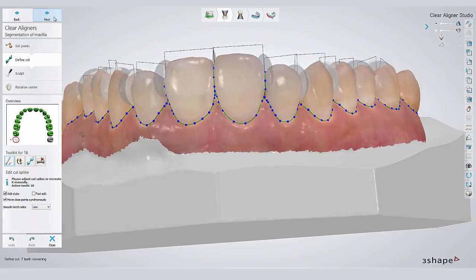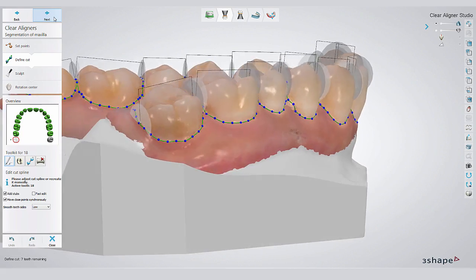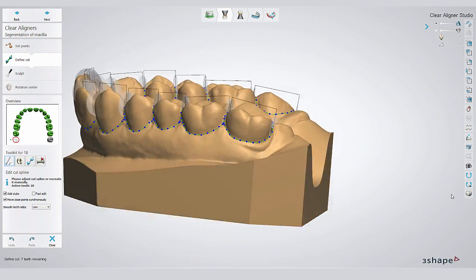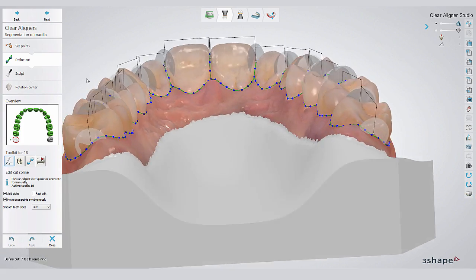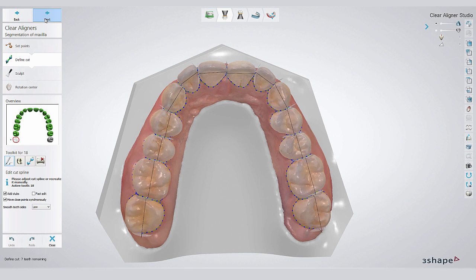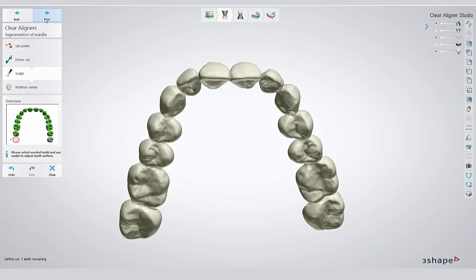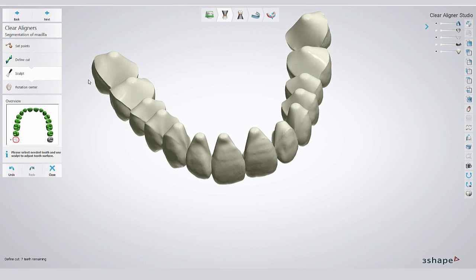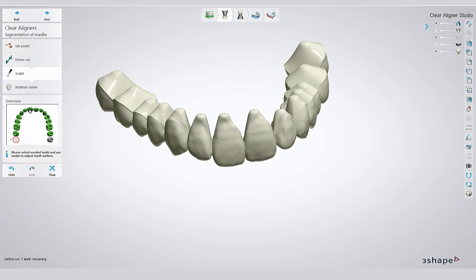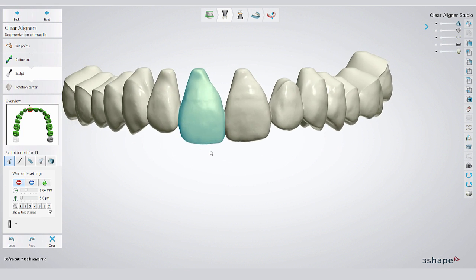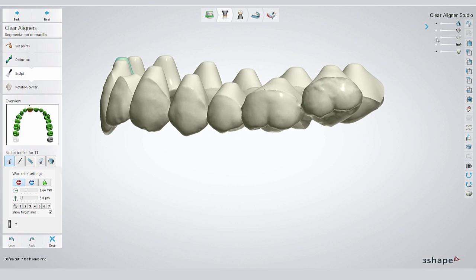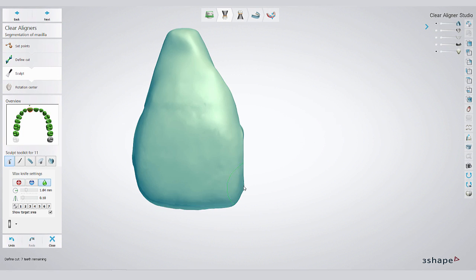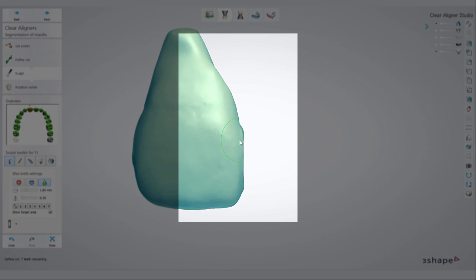Make sure that you double-check all those lines, and in case you have to, you can edit them and correct them. A click on Next will then initialize the segmentation. Critical zones are always the interproximal areas, which should be controlled. You can use different tools to sculpt and fine-tune those areas if you wish or have to.